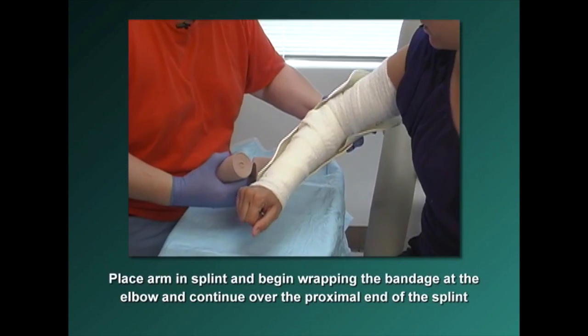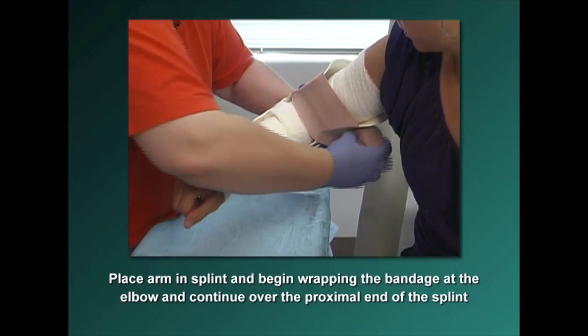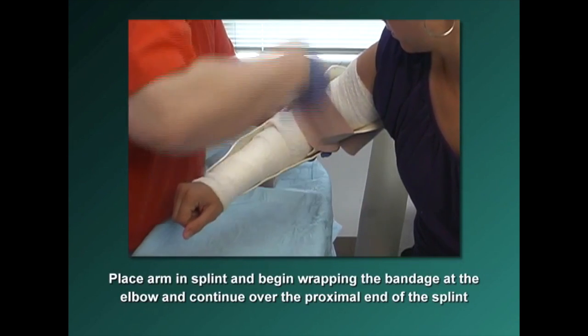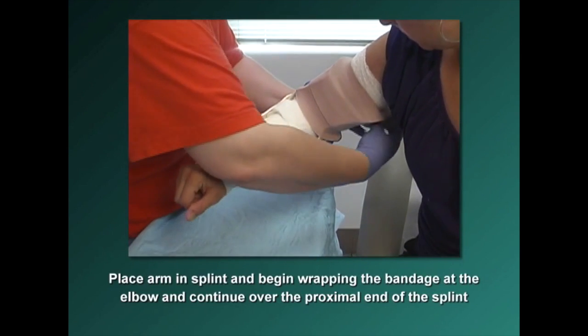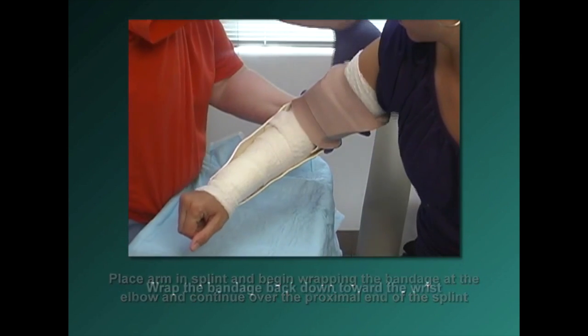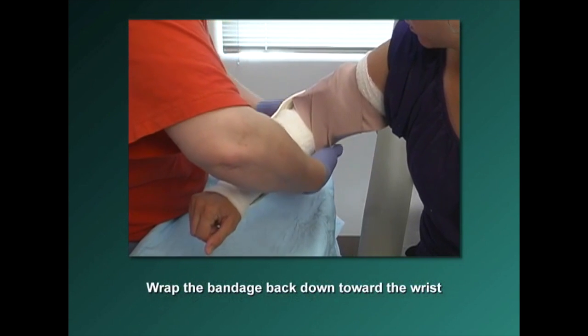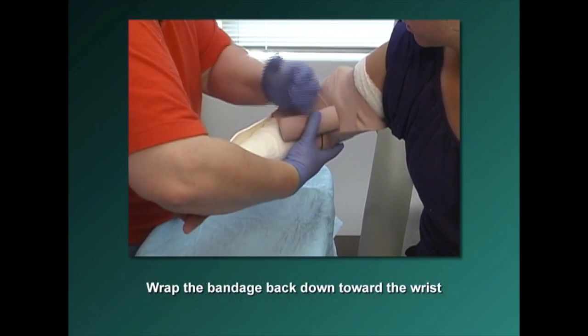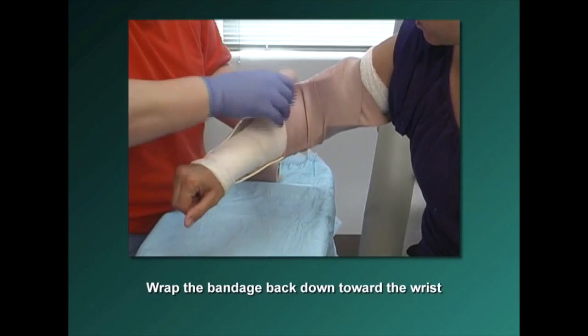Place the arm into the splint and begin wrapping the elastic bandage at the elbow, making sure to wrap over the proximal end of the splint to prevent the splint from migrating. Wrap the elastic bandage back down toward the wrist. This splint should extend to mid-hand and the distal end of the splint should be wrapped as well.